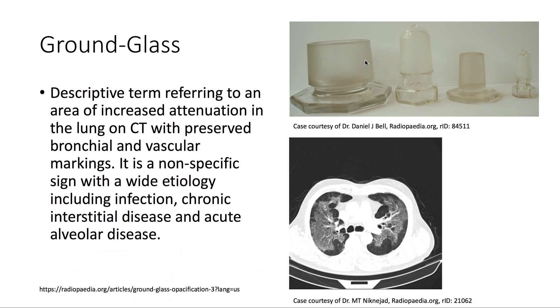Ground glass, as shown here, is a descriptive term referring to an area of increased attenuation in the lung on CT, with preserved bronchial and vascular markings. It's a nonspecific sign with a wide etiology, including infection, chronic interstitial disease, and acute alveolar disease.